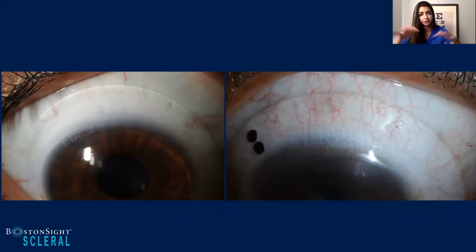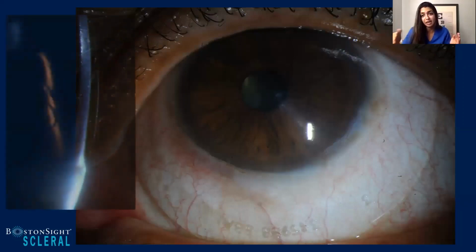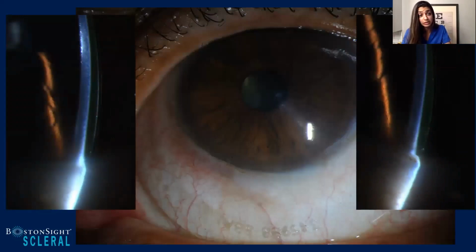This was her superior scleral alignment. But then one thing I noticed inferiorly was I had this congested appearance on both eyes inferiorly with very mild conjunctival prolapse. And then using my optic section and increasing that magnification, what I realized was my inferior limbal clearance was a little higher than I preferred. And that was also creating partly this dragging of that conjunctiva, which we often describe as prolapse or bogging.